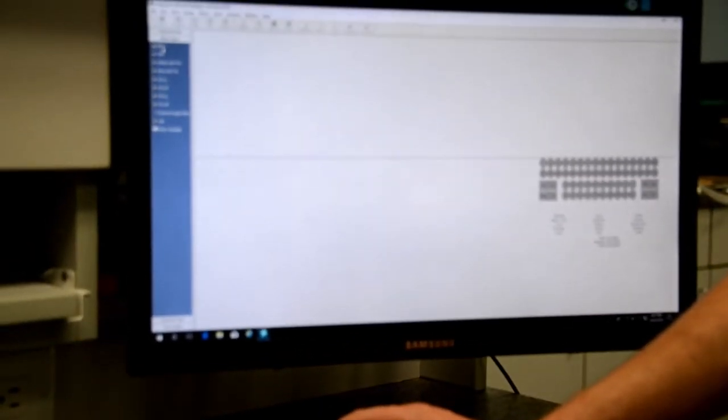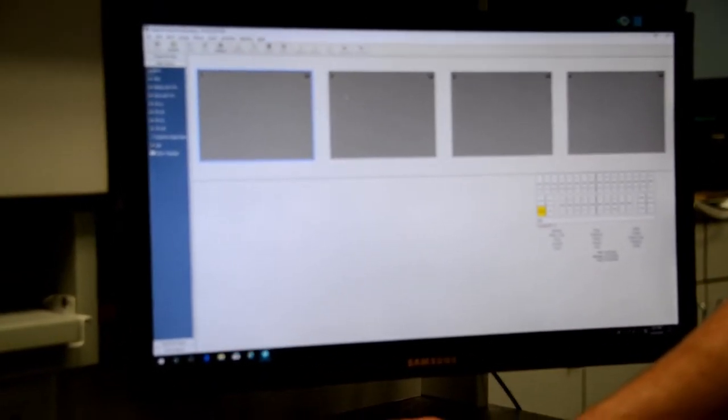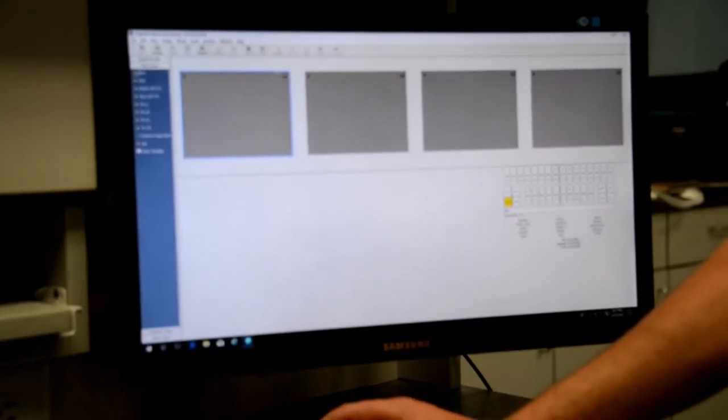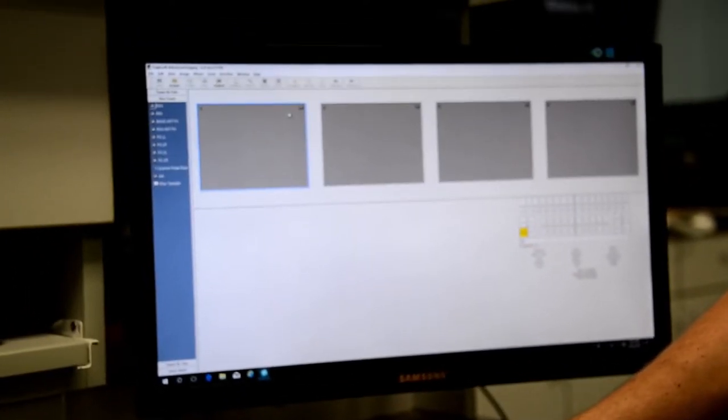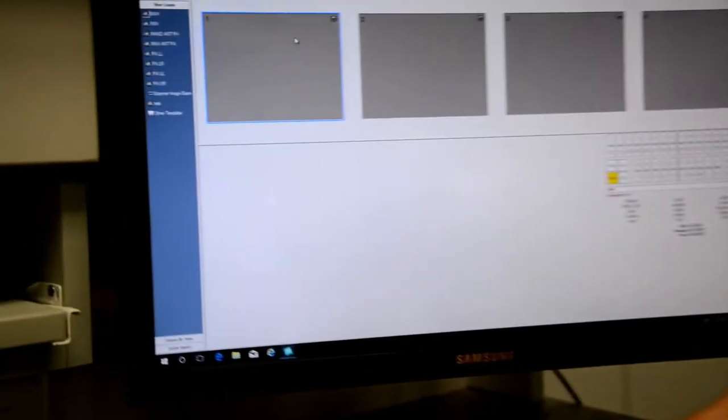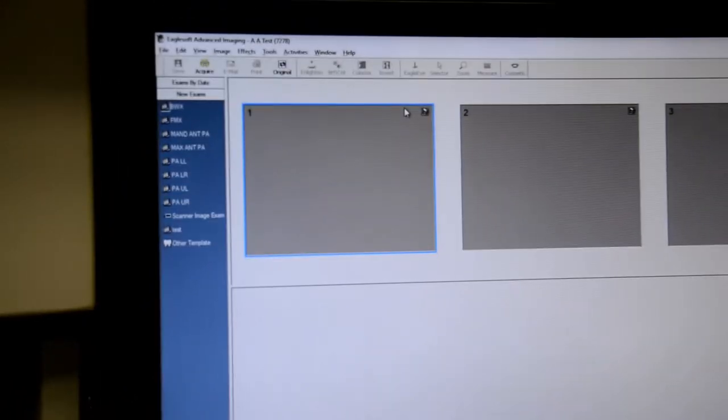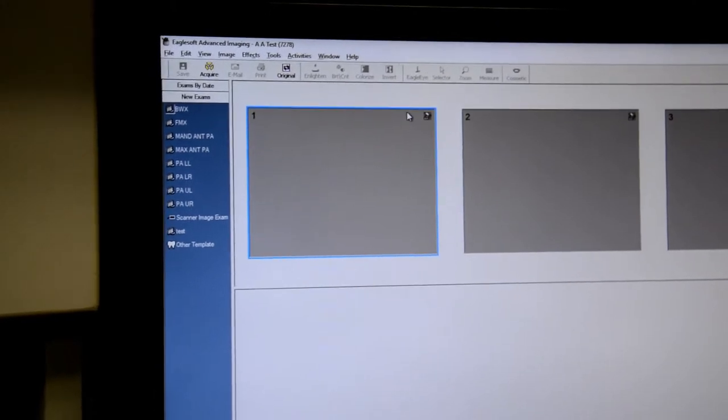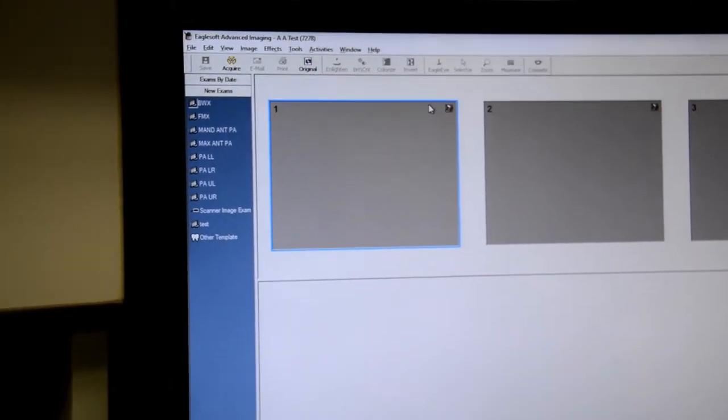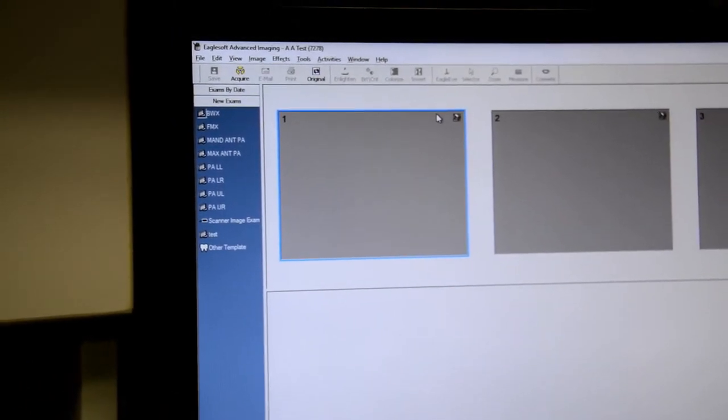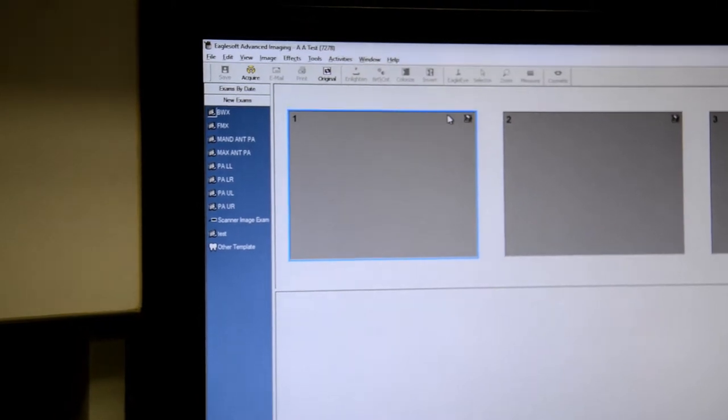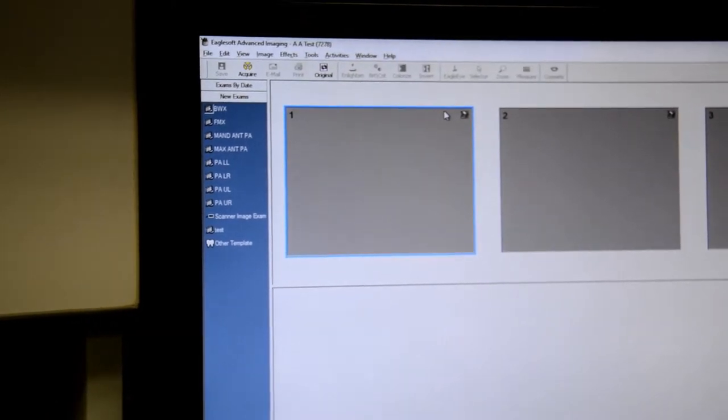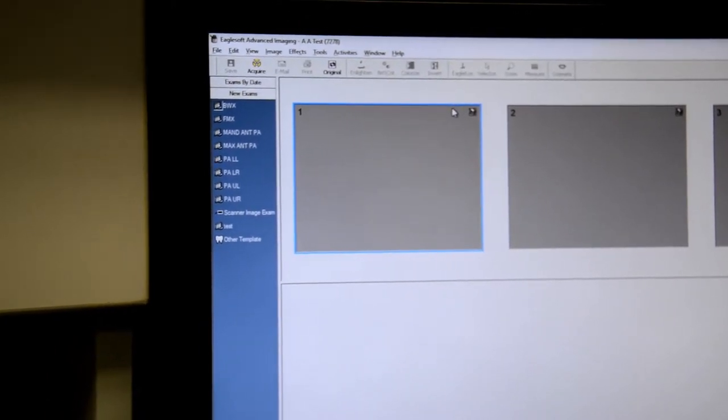So first off I'm going to select our ByteWing and as you can see up in the top there is a little scanner button. That's because this template has been set up to use the third party internal scanner or a twain device. So any sensor that comes with a twain or has the ability to use a twain can be used as a third party sensor in Patterson Imaging.